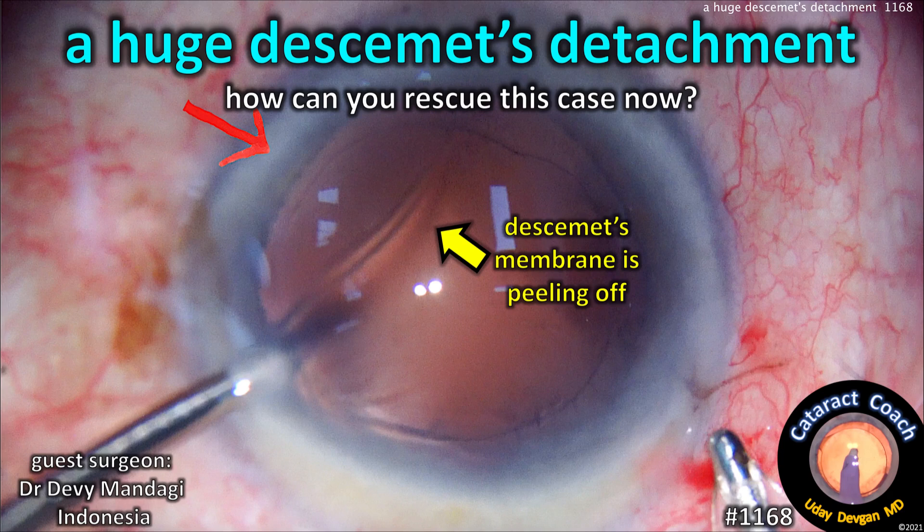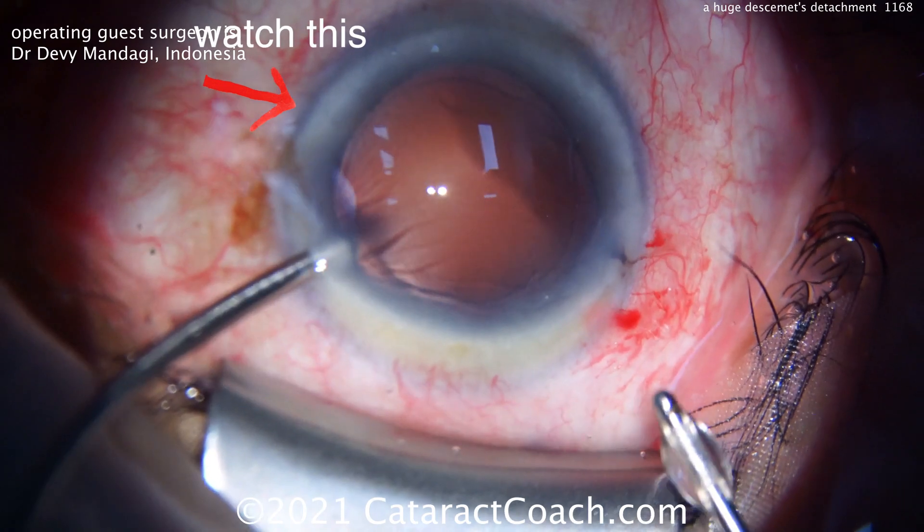CataractCoach.com — a huge Descemet's detachment. How can you rescue the case now? A guest surgeon, Dr. Devi Mandagi from Indonesia. Great case. Watch carefully.